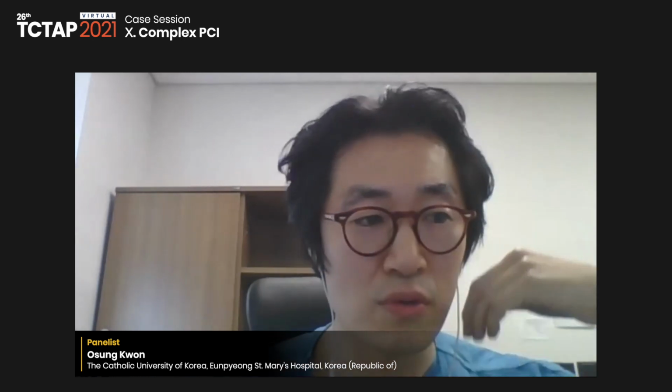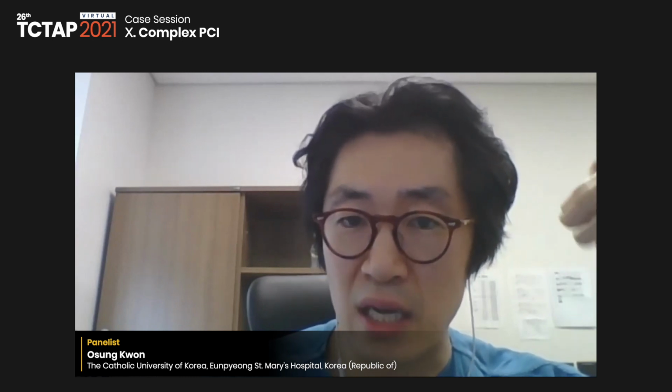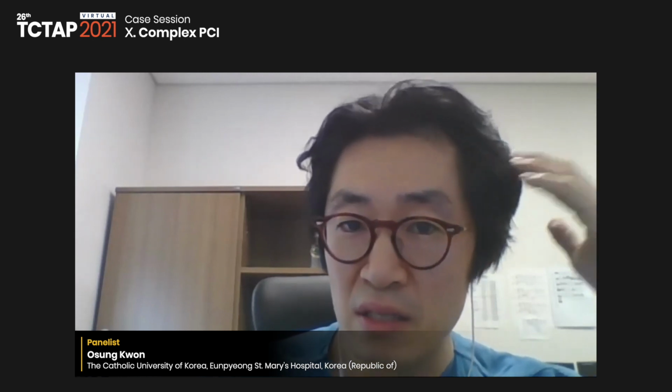Thank you for your nice presentation, Dr. Low. I have one question for you. Is there any concern in terms of long-term outcome limitation, because the heart is always beating, and the implanted device has a tip or some material that is not round, so it might irritate the pericardium all the time. Is there any concern about reports of irritation or effusion after putting in the implant?